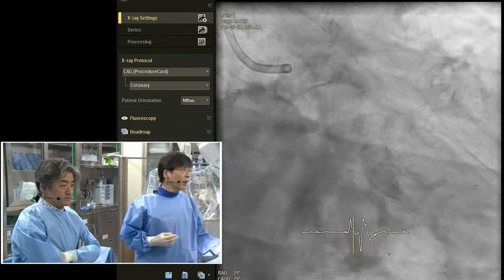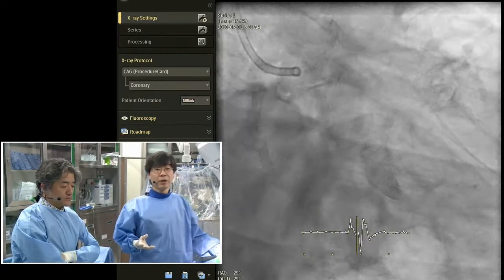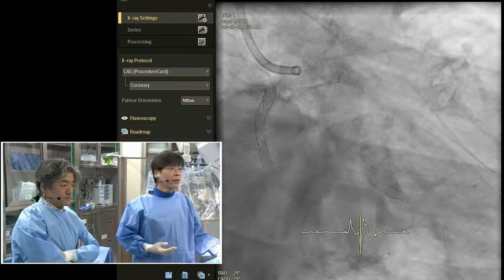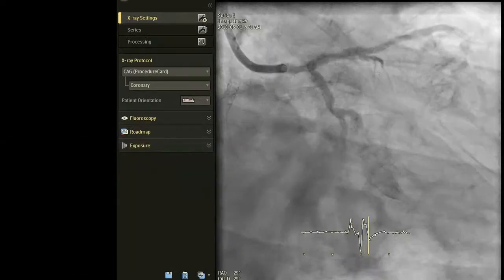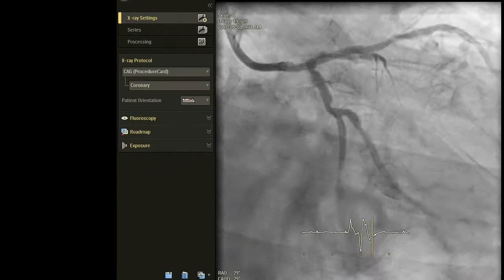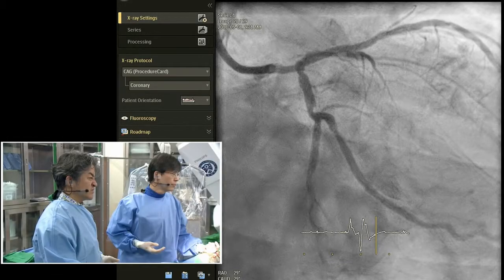So to evaluate the coronary status, we do the IVUS from the LAD and CIRC. Okay, Dr. Kim, please. Did you do some kind of simple Finet calculation, taking the circumflex diameter and the diameter of the LAD, and conclude really that this main stem is clearly more than 50%?